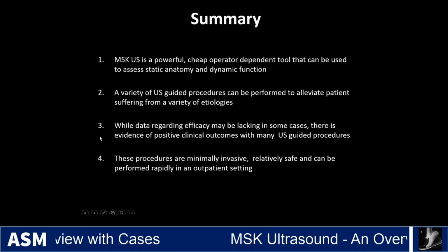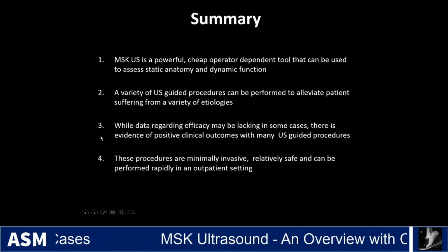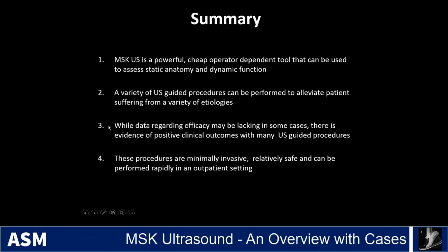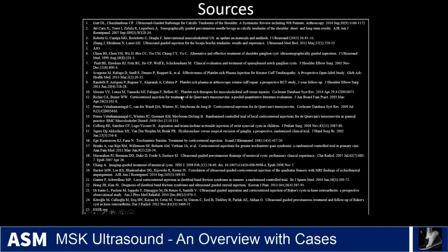Hopefully this talk will help prepare for the board exams for the radiologists and for other people out there who are not studying for boards, just to become more familiar with MSK ultrasound from a diagnostic and procedural perspective.